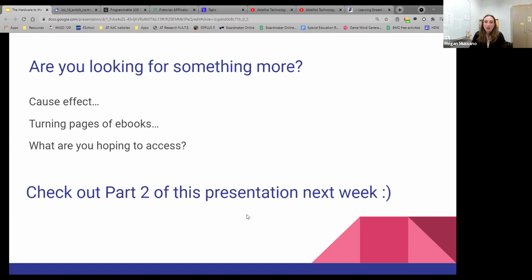I'm going to go through all the step-by-step process of how you, on your own, add a switch to an iPad and program it for a gesture or a custom gesture. Once you have all your switches programmed, I show you how to combine them in a recipe so that all we have to do is triple click to turn it on, and then this iPad is switch accessible. So between now and next week, try to scrounge around, see if you can find any adapters, bring some of your switch accessible hardware, and we can do some programming next week, which is the really fun part.